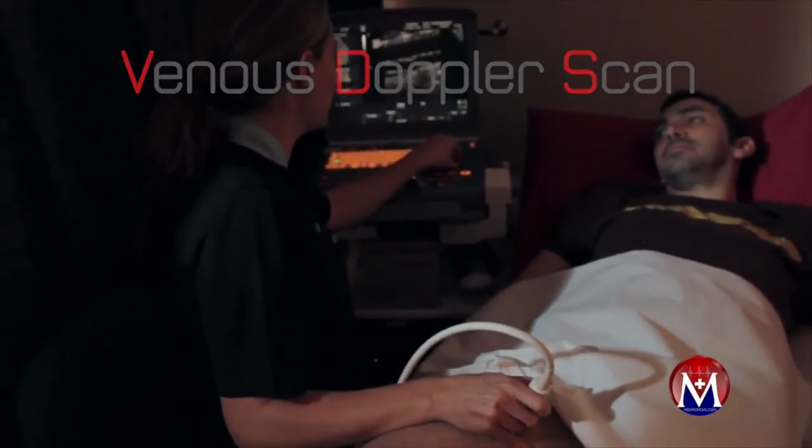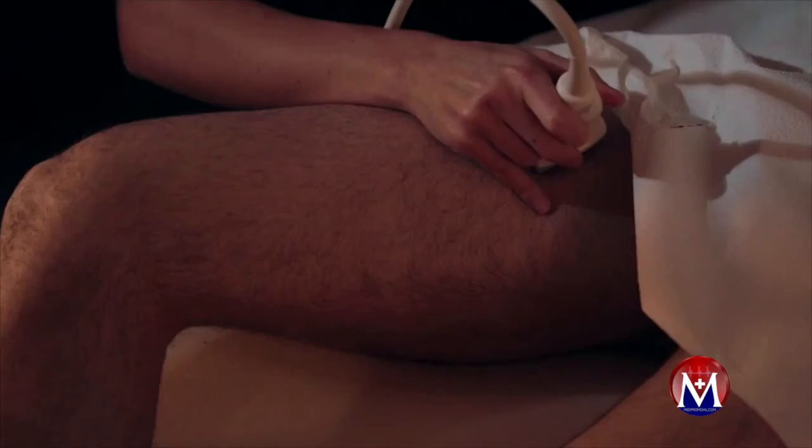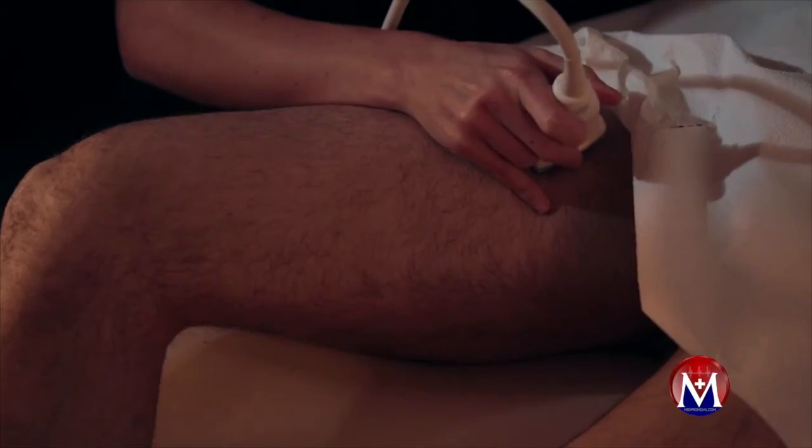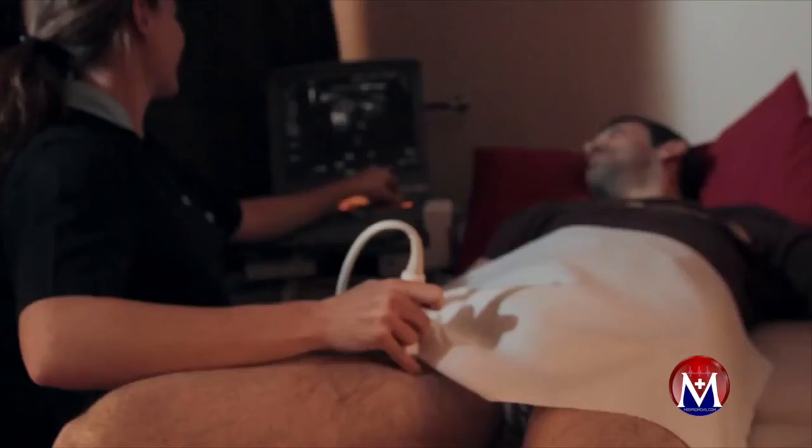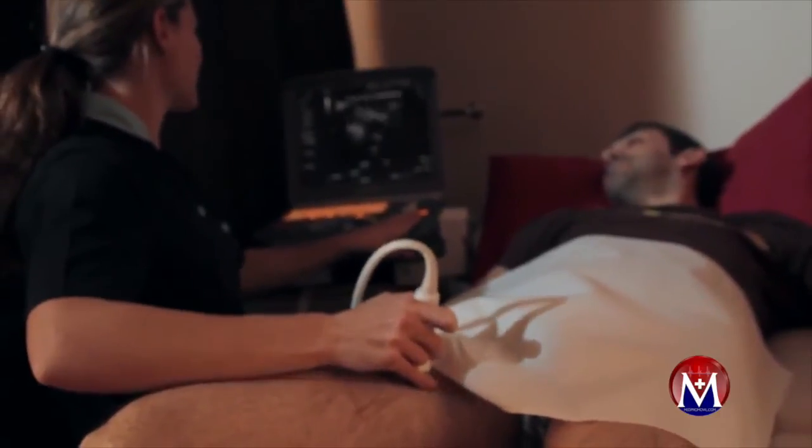The most common reason for referral for a venous ultrasound is to rule out deep vein thrombosis, usually in the arm or leg. We require a letter from the patient's GP in order to carry out the scan.